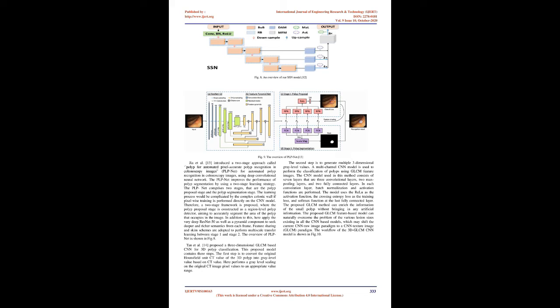Tashk et al. 10 proposed a network, which has a novel UNet architecture. This paper adopted a novel approach for fully automatic polyp detection. This includes three main steps. First, a pre-processing step is applied to the dataset images. The pre-processing comprises three distinct color transformations known as Lab, CMYK, and gray level. In the second step, the UNet is proposed for segmentation, and the final step is post-processing for improving the pixel-wise classification outcomes.